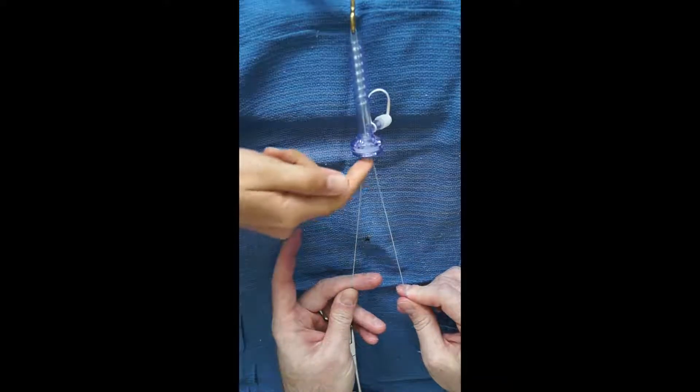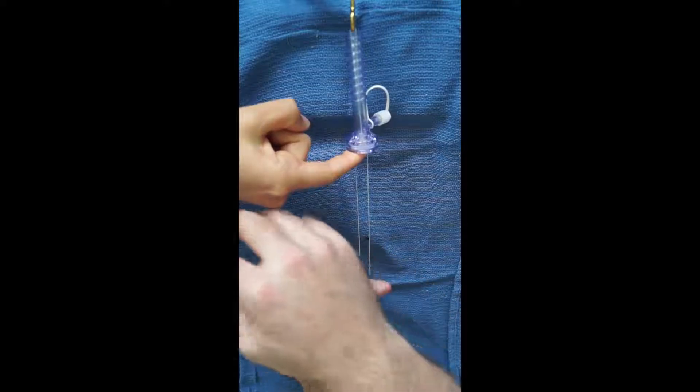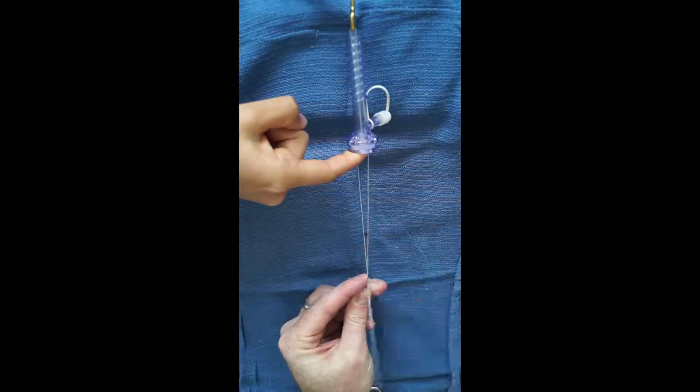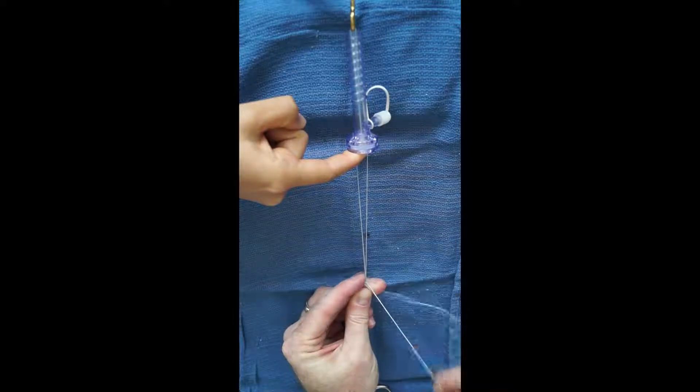When tying the knot with the cannula or portal, an assistant may place a finger between the suture limbs and rest it on either the opening of the cannula or the portal. This will assist the surgeon in separating the two strands and aid in easier knot tying.